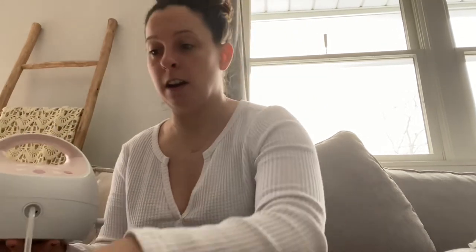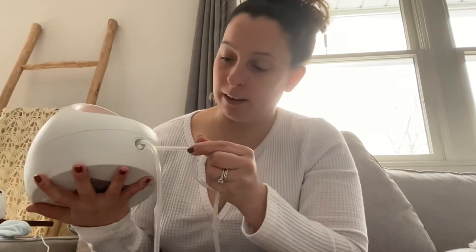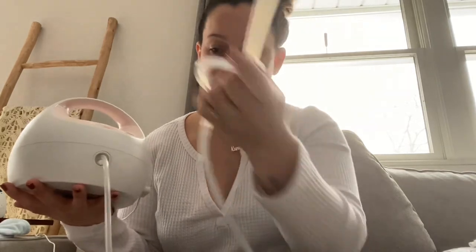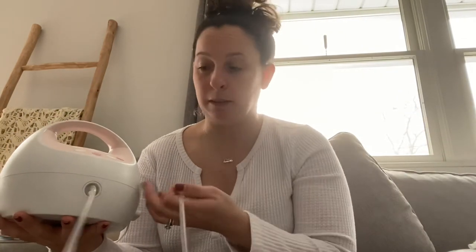If you're pumping on one side you leave the other hole covered — it won't work if you have that open because it won't suction properly. If you do both sides at one time and you have one of those hands-free bras, you can use your second tubing and plug it in — just take the rubbery piece off and plug it into the hole. The tubing never gets washed or you'll ruin it, so that's really the only piece you can't wash besides the pump itself.